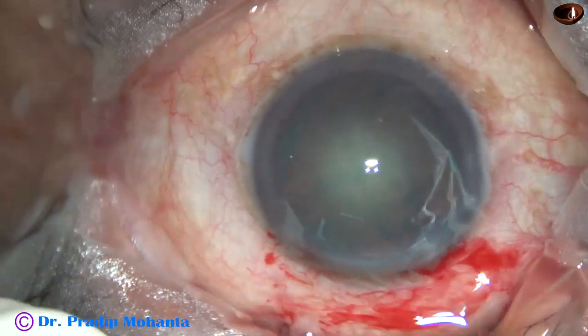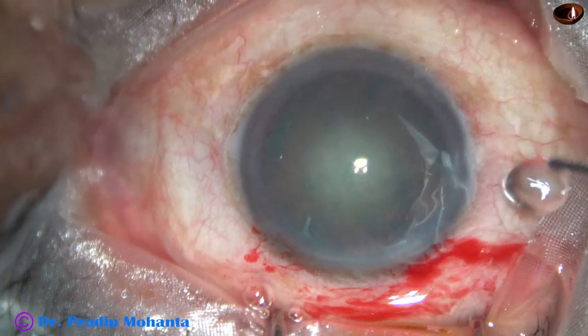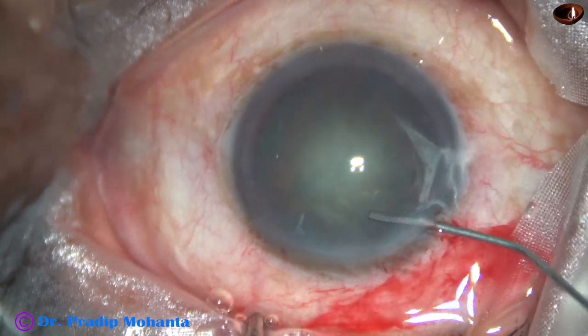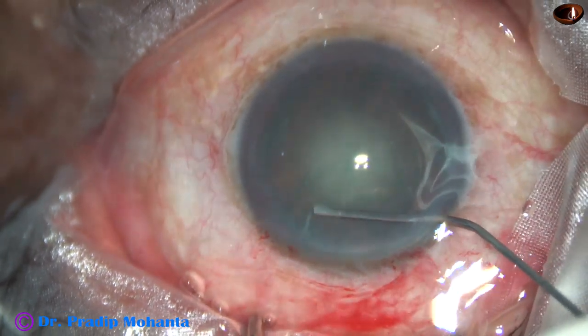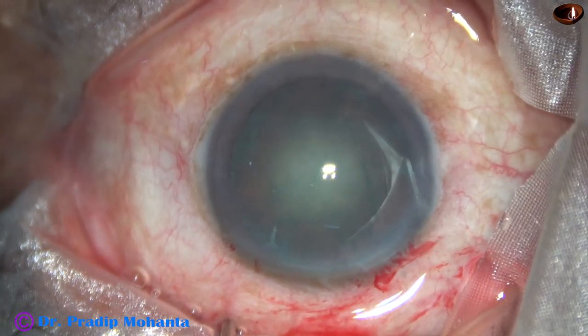Hydrodissection by a 27-gauge cannula attached to a 2 cc disposable syringe. The fluid wave is passed, and I look at the fluid wave as it goes to the opposite equator.